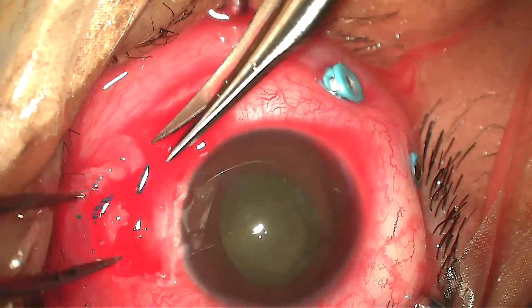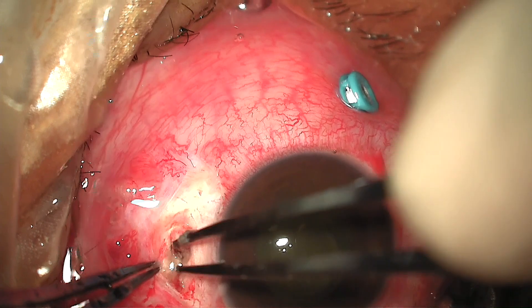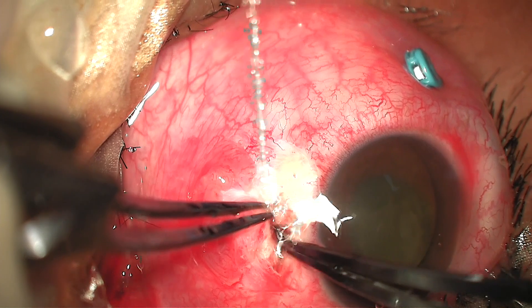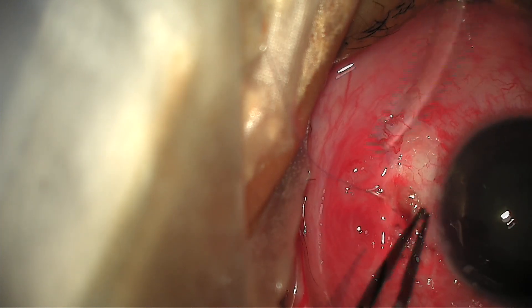Moving on to the surgery, a conjunctival opening was made and the scleral rupture was revealed. The scleral defect was first cleared of all debris and then repaired using an 8-0 vicryl suture.